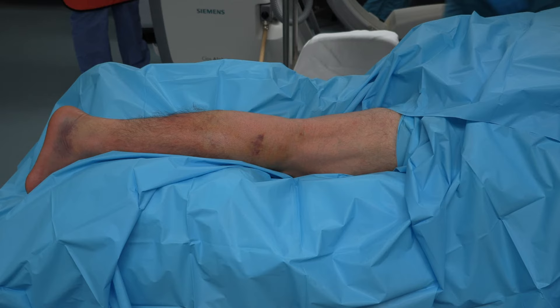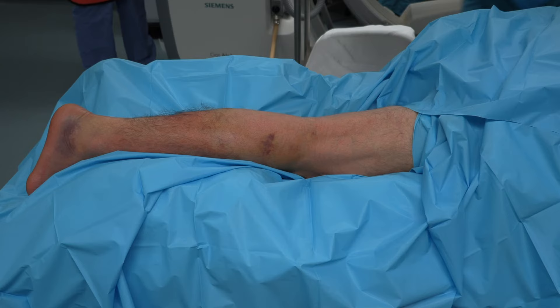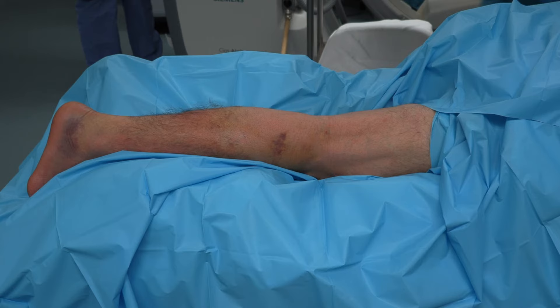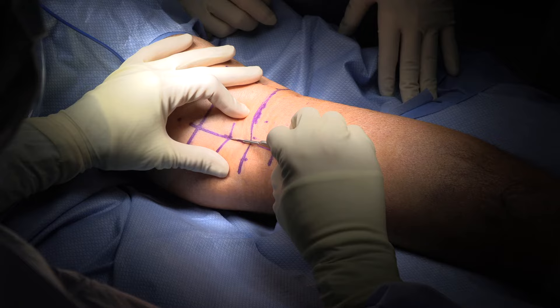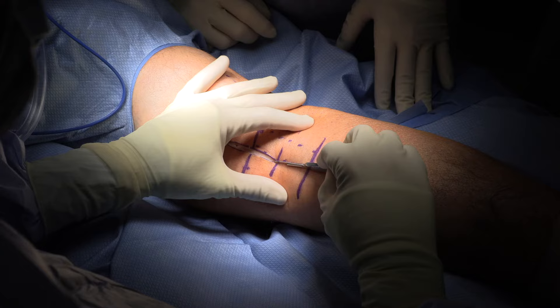The patient is positioned in a prone position. Care must be taken to avoid excessive abduction and external rotation of the shoulder, as this can lead to a shoulder dislocation in patients with previous instability. The arm should also be well padded over the medial aspect of the elbow to avoid an ulnar nerve palsy. The interval is identified and marked between the semitendinosus and medial head of the gastrocnemius. The leg is exsanguinated and the tourniquet is inflated.